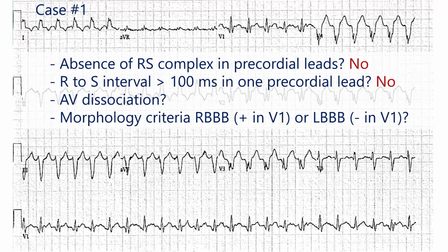And is it a stable rhythm that's truly dissociated from the ventricular rhythm? The one thing you can do to ask that question is to check the timing between the atrial activity that you suspect you see and see if it's consistent, and ask yourself, is there truly a rhythm present or not?